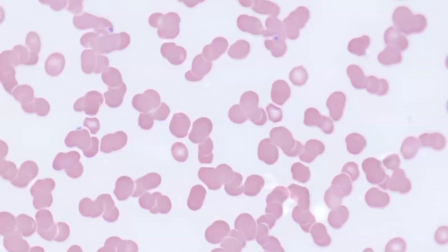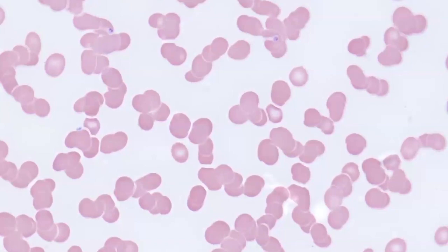However, we're not able to appreciate that on this smear, primarily due to the fact that this does not project as well via video. Increased amounts of globulins and fibrinogen, which have a net positive charge, bind to the surface of red cells and neutralize their net negative charge. So the red cells, instead of repelling each other like normal, they actually begin to stick together and form primarily rouleau. Occasionally, several rouleau areas will agglutinate together and may form rare foci of red cell agglutination. Clinical conditions associated with red cell rouleau include multiple myeloma, as seen in this case, Waldenstrom macroglobulinemia, which is often caused by a malignant lymphoma, and infections or inflammatory conditions.